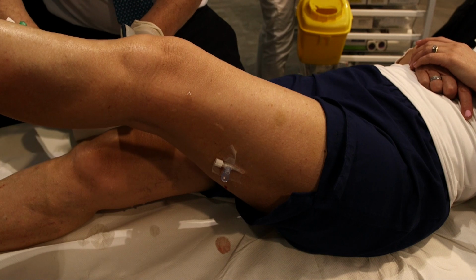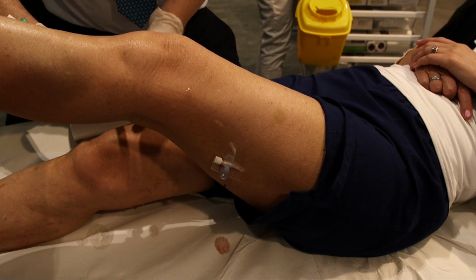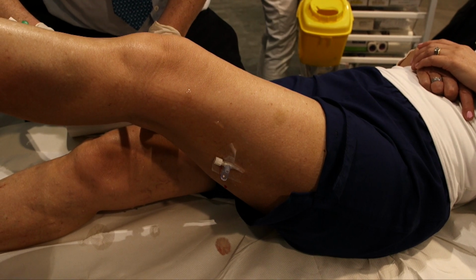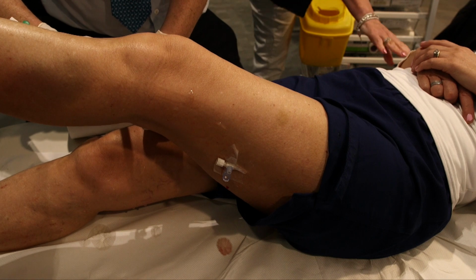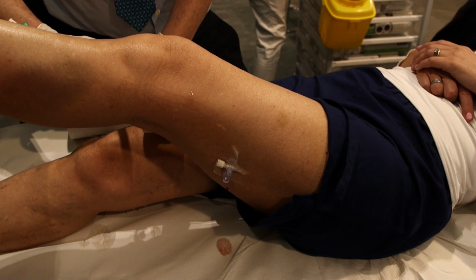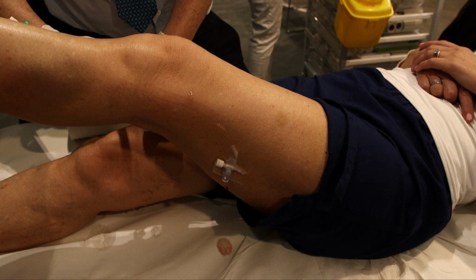Yeah, that's good. Well, if we look at the veins, you can see little white dots where the veins were. Sorry? You okay? You good? So this white dot right in the middle of the screen is the saphenous trunk proper. And I'm just putting a little bit of foam in there.